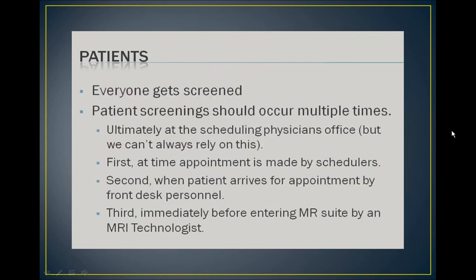Everyone having an MRI gets screened. This includes patients, family members, and anyone who may be entering the MRI room. All technologists, receptionists, radiologists, tech aides, and nurses must be appropriately screened if they intend to enter the MRI scanning room. The MRI technologist must understand the risks involved with MRI. There are many implantable devices, pumps, and other electronic accessories that may cause a problem in the magnetic field and can become dangerous to the patient or staff.